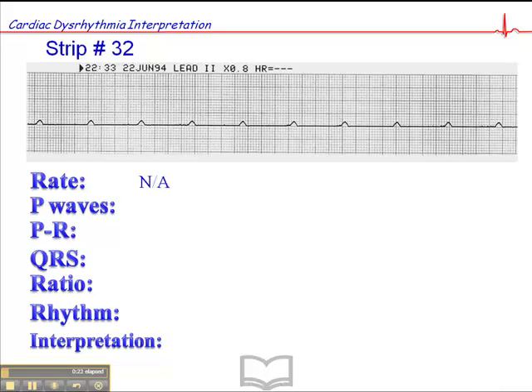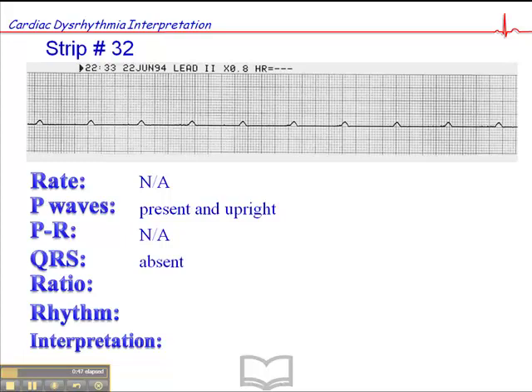For starters, there's no rate here really because there are no QRS complexes. All we see are P-waves. The P-waves are present and upright and contoured. There's no PR interval because there's no QRS. So if there's no depolarization of the ventricles, the patient is dead. They're dead because if the ventricles aren't contracting, they've got no cardiac output — they are vital signs absent. We have no QRS complexes, there's no ratio.